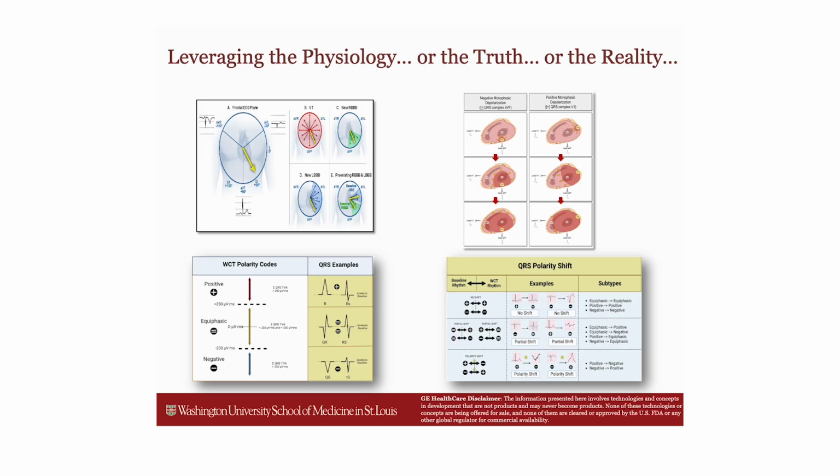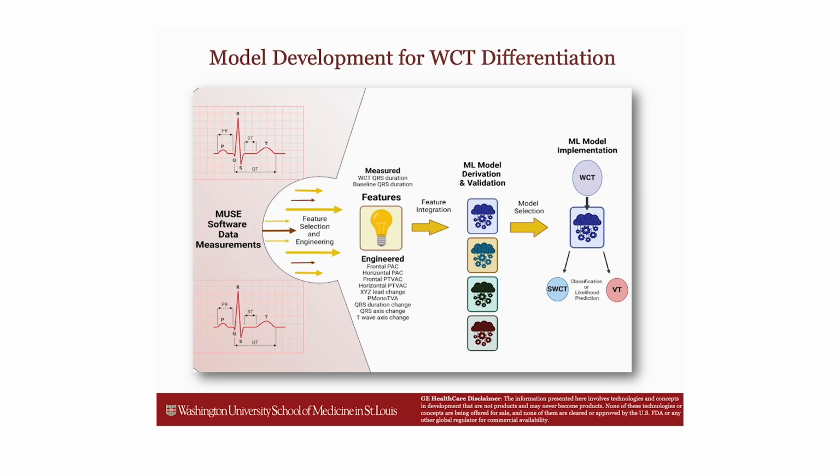So what we did was create novel features through a process called feature engineering. Some of the ideas are shown above, all of which have a foundation or ground truth in electrophysiologic principles. I don't really have time to discuss these parameters in detail, but based off these ideas, we formulated novel features. We then put these novel features into models, not just raw measurements. So this is how it works.